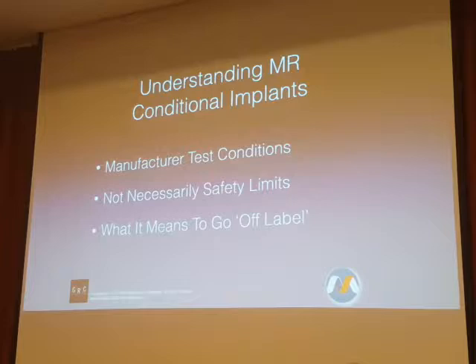You guys came up with, I'm making up the numbers, 7,000 Gauss per centimeter. I ran the numbers and you had a math error. It's actually double that. It's 15,000 Gauss per centimeter before you get to this threshold.